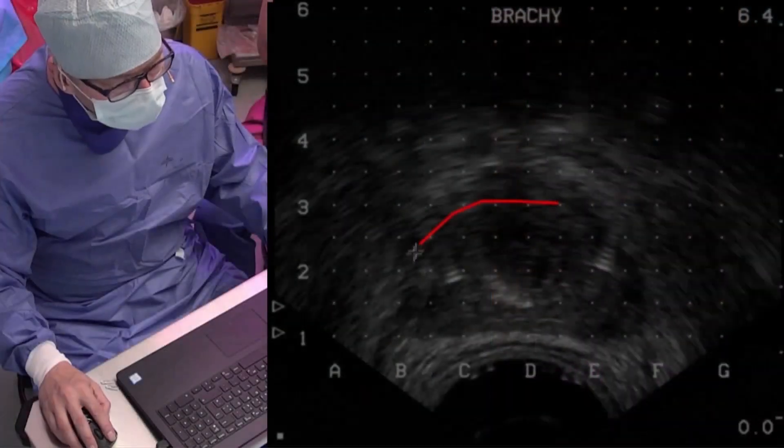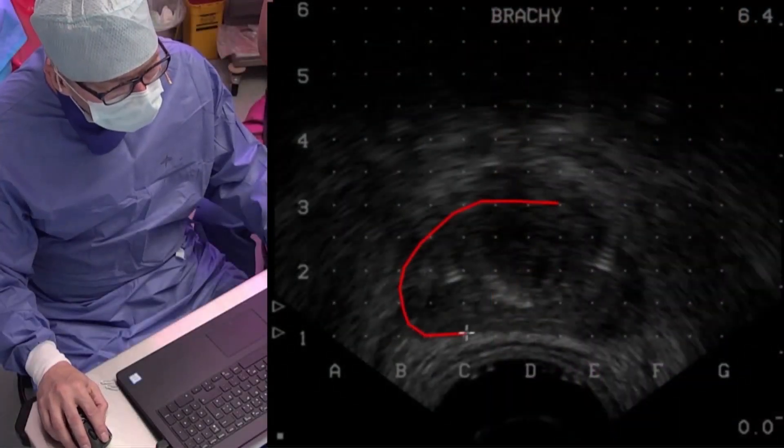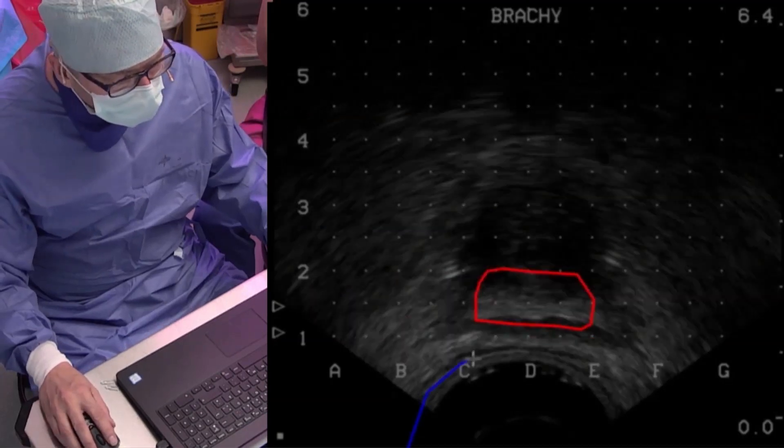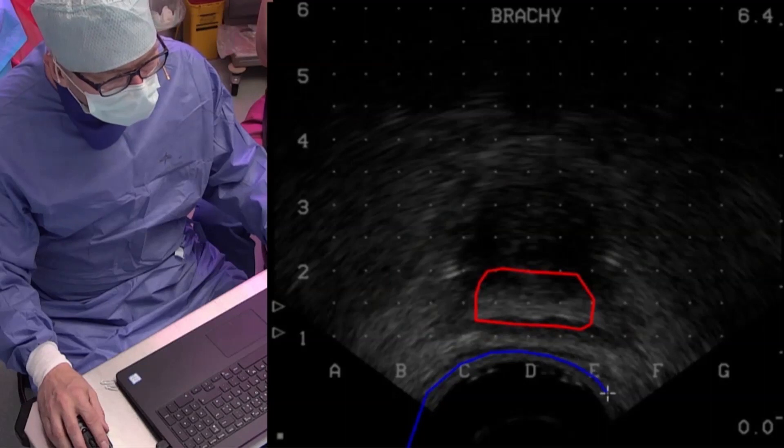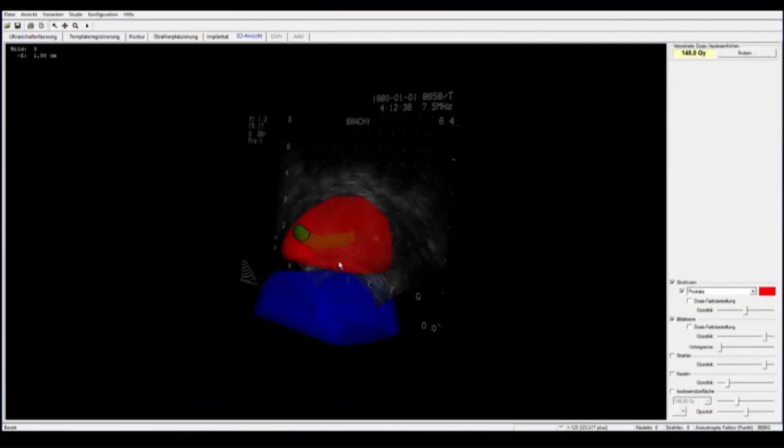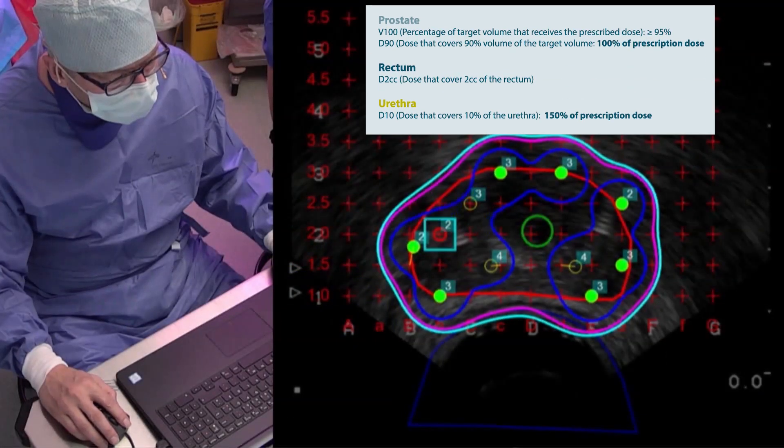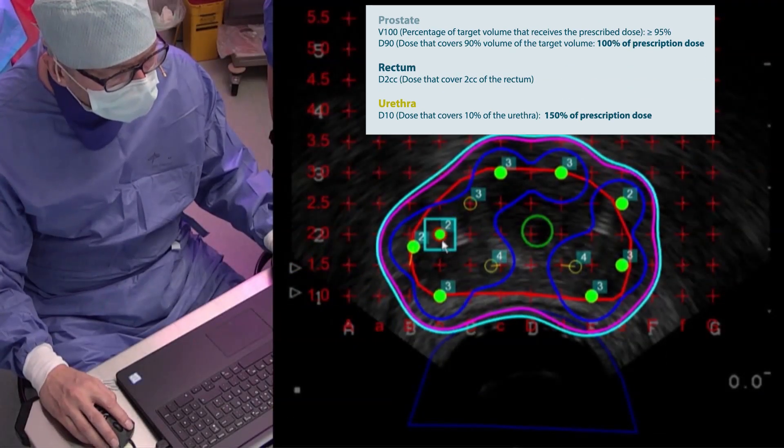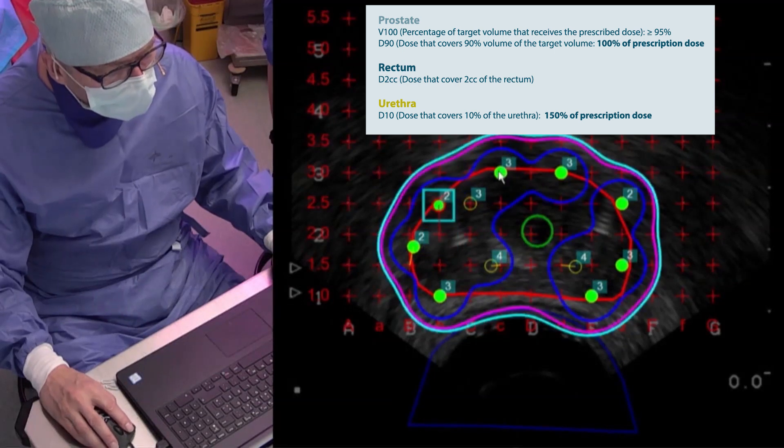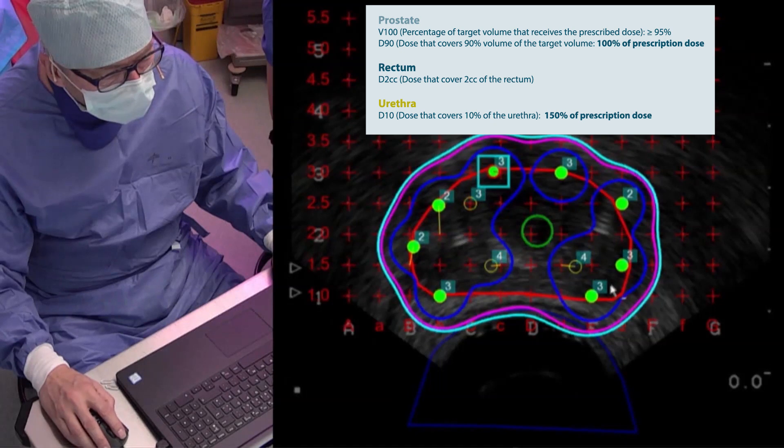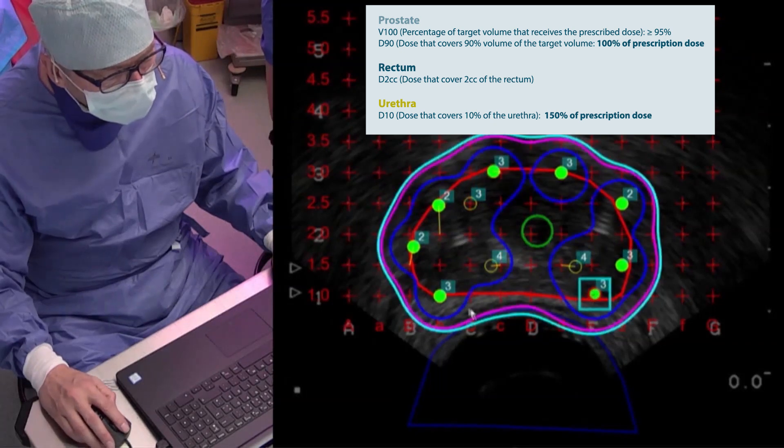With the help of the ultrasound images, the physician can determine the exact contours of the prostate and the surrounding regions. Based on the determined size and shape of the prostate and adjacent organs, the physician can now calculate the exact number of seeds required and their optimal positions within the prostate with the help of the treatment planning software.